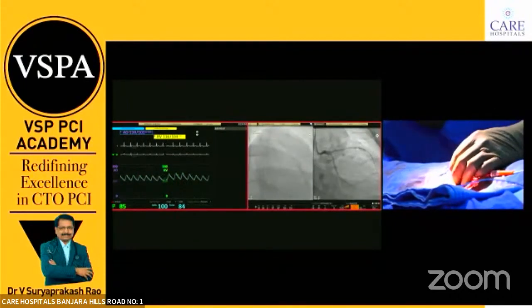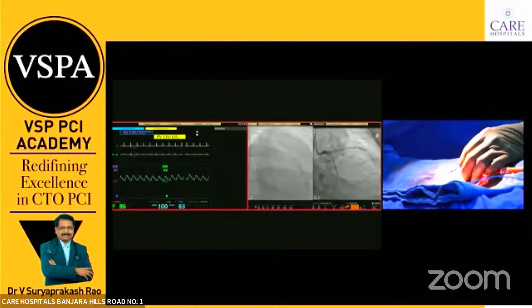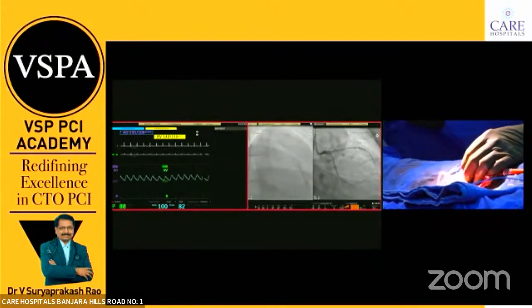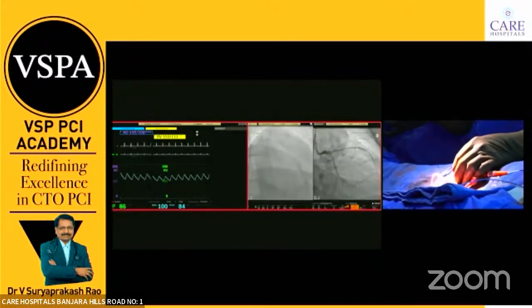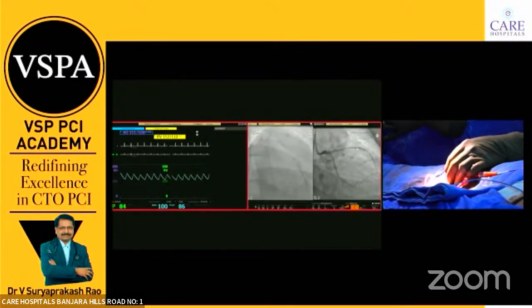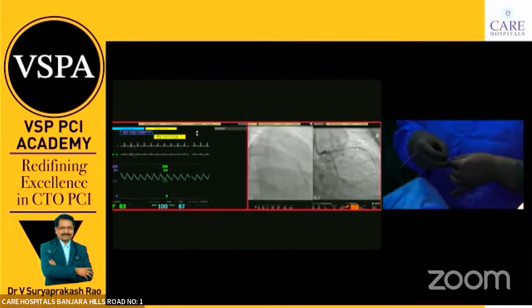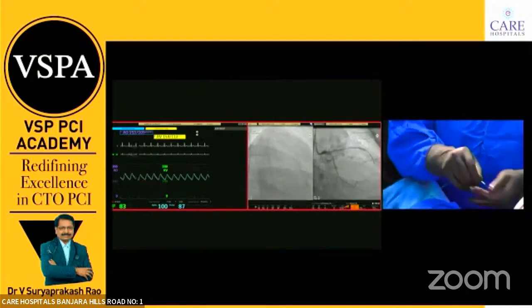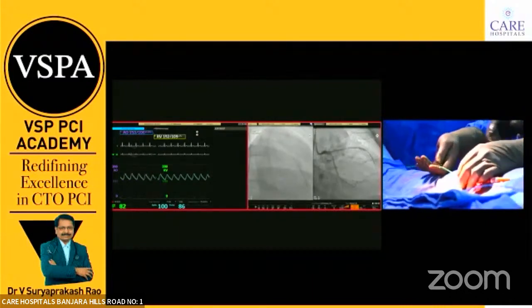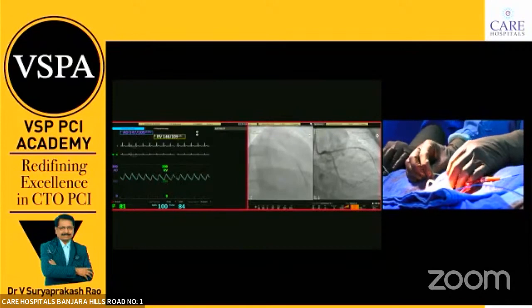No, that new system, they claim 90%. Rad pad not that much, they say 50% scattered radiation. Because once the patient is obese, the radiation dose is high.